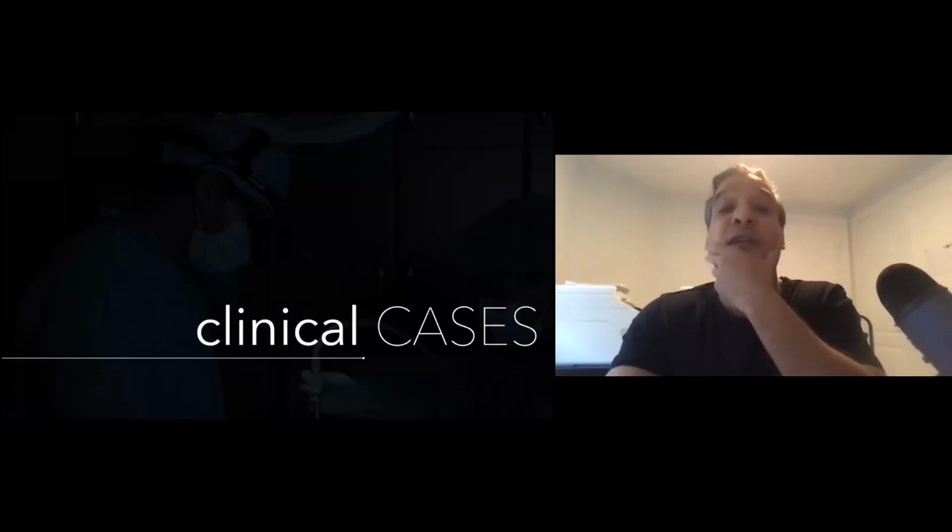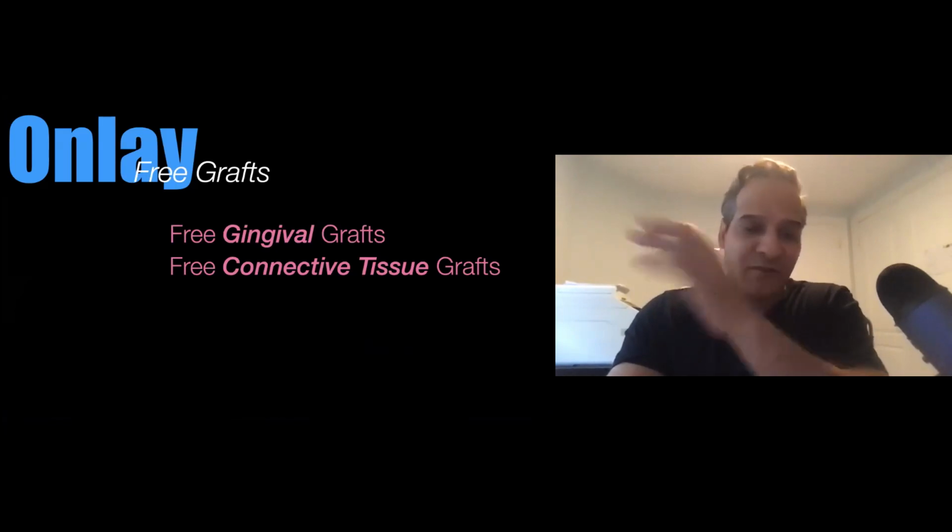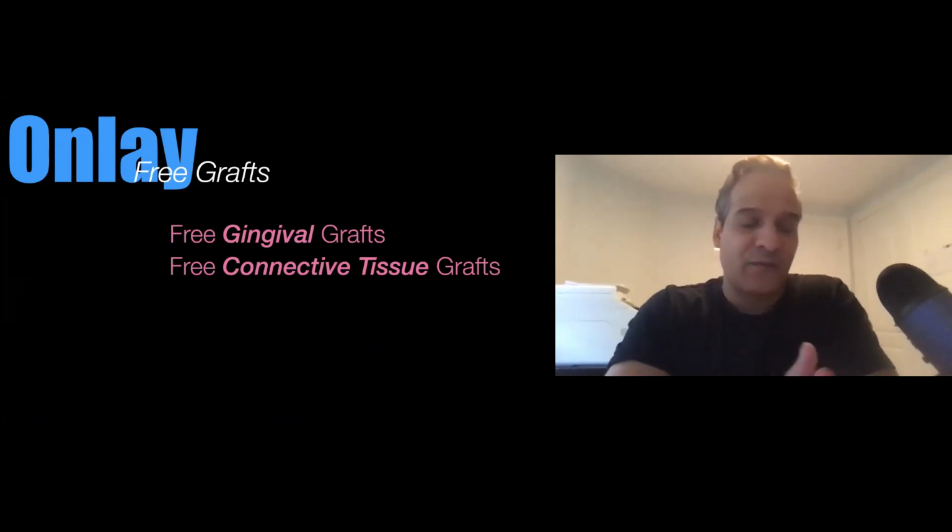I'm going to start with a basic free gingival graft case. This is actually a really old case. I think it was when I was a resident. So free gingival grafts, number one, I call them onlay grafts because they sit on top of the surface of a recipient bed. There's no flap that goes over them.